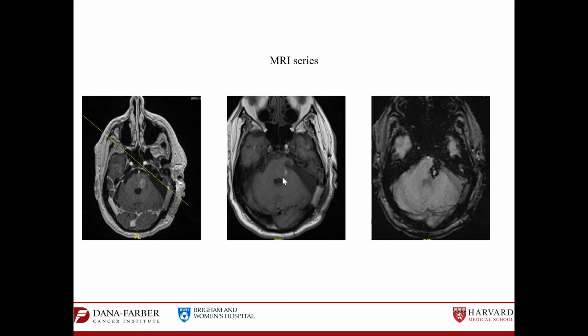The one I've used here is a thick-cut T1 pre-contrast, so it's not really aligned to the same cut, but it can give you a rough idea. If you see anything bright on T1 pre, we are looking at blood products. If it's bright without contrast, then you're looking at blood products and post-surgical changes, which points more towards not a residual disease.